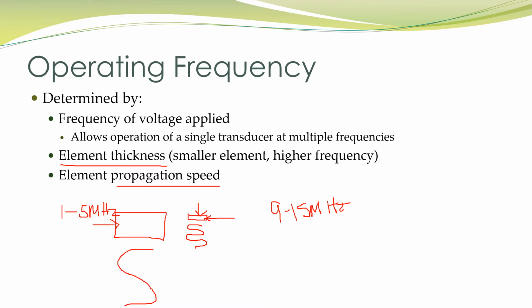They would be capable of any frequency within that range. And I'm trying to scan, say, the popliteal vein, and it's diving a little bit deeper as it proceeds towards the calf. And all of a sudden, the really high end of my frequency is not getting me the penetration that I need. I could adjust my frequency from the 15 to the 9, either directly or indirectly, as I mentioned.